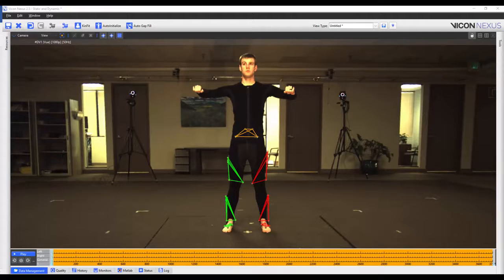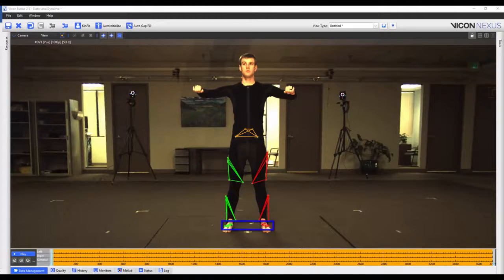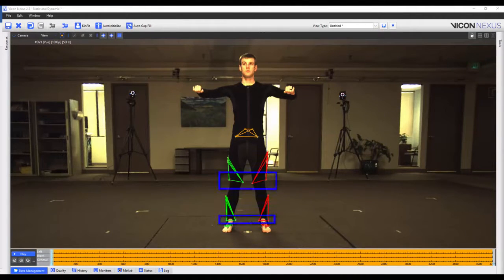The first thing we have done is we have placed four marker rigid body clusters onto our subject segments. These segments are the pelvis, the thighs, the tibias, and the feet. We've also placed markers on the medial and lateral ankle and knee joints.